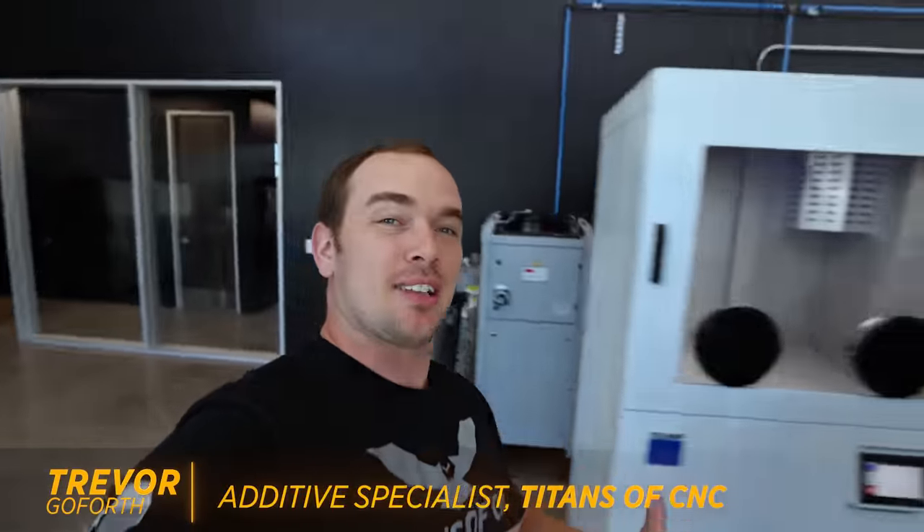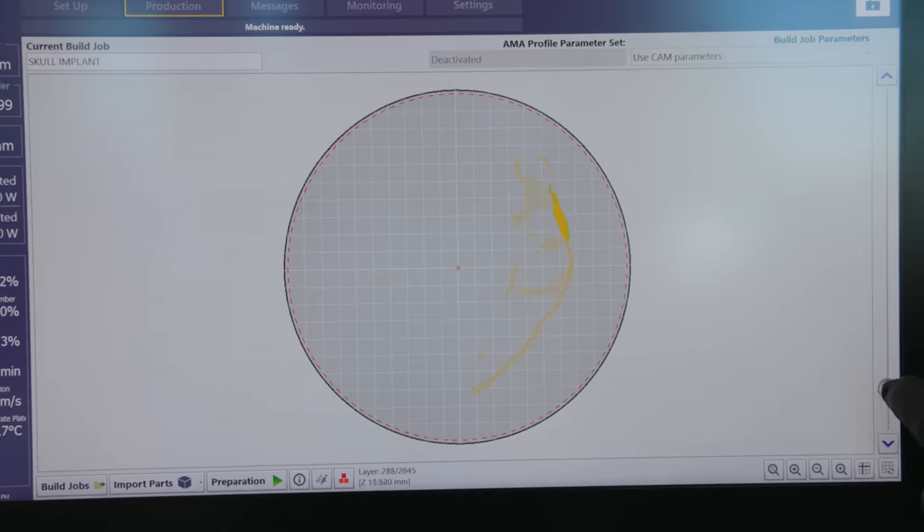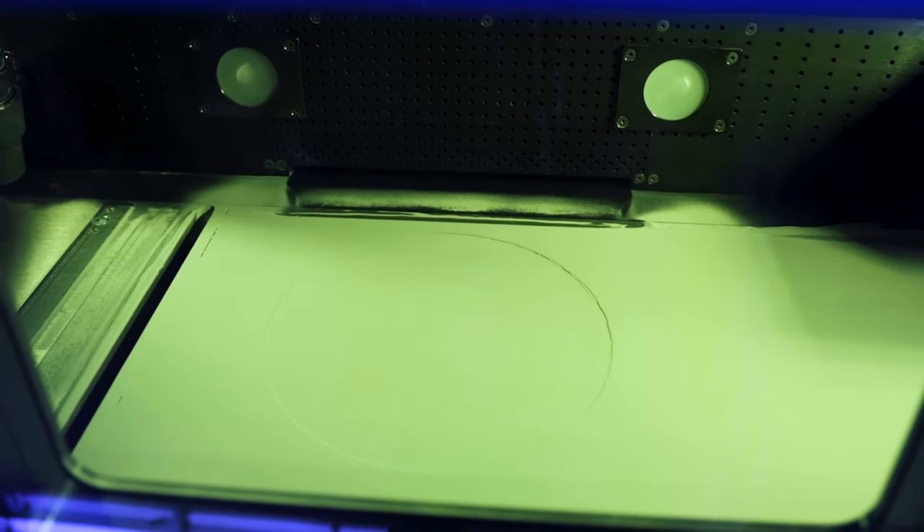I got something really cool to show you guys. I just finished 3D printing probably the most important part of my entire life, but I haven't even seen it yet. Inside of that powder is a 3D printed human skull implant that's going to be surgically installed into someone's head and completely change their life.